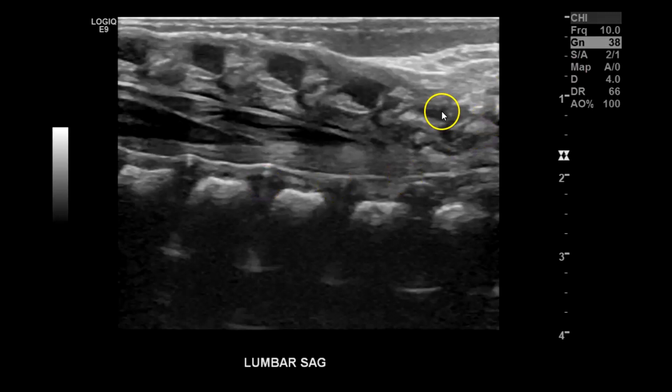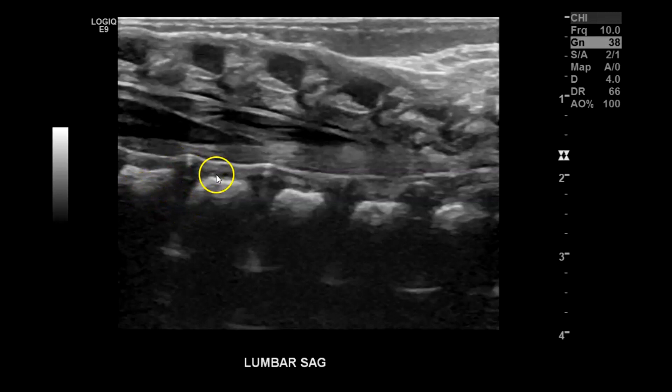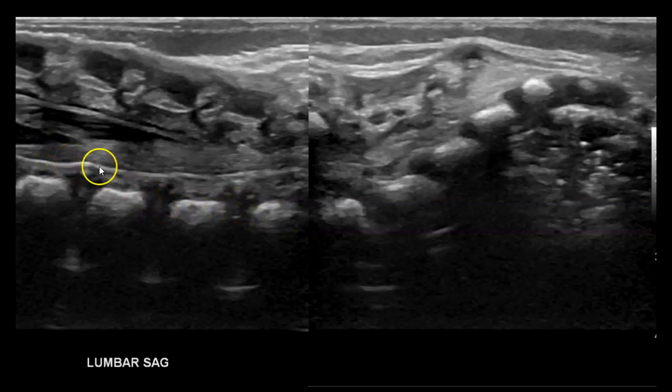I dropped it from 11 down to 10 — you can see how much clearer the lumbar vertebrae and conus medullaris appear. If you're having trouble getting a panoramic view due to movement, you could also do a dual screen. With the dual screen it almost looks like a good panoramic — you can see the conus, the lumbar vertebrae, and the sacral vertebrae, and then do your counting.